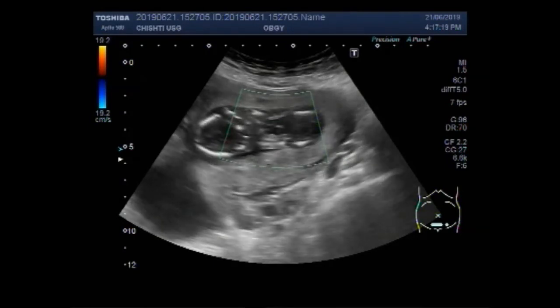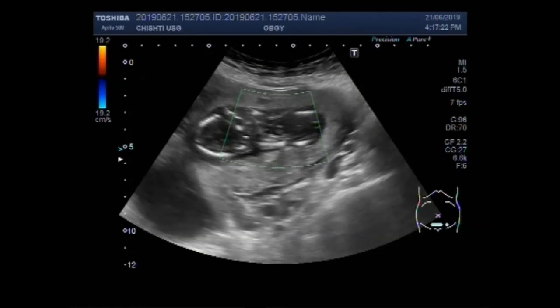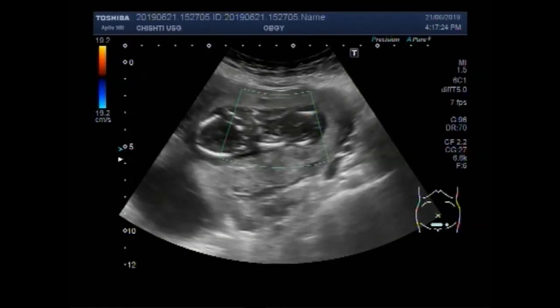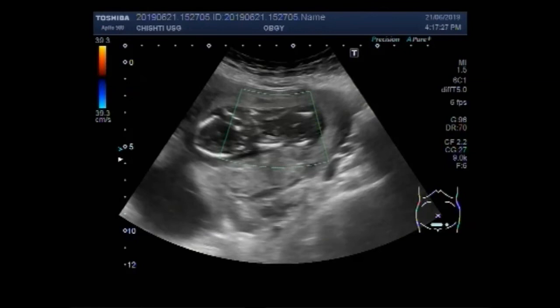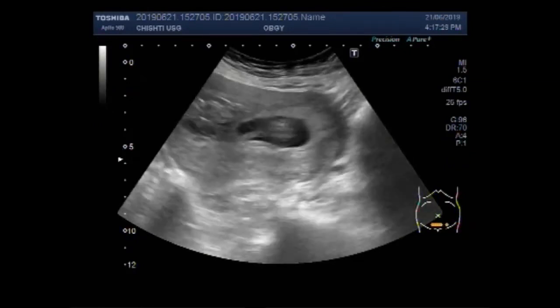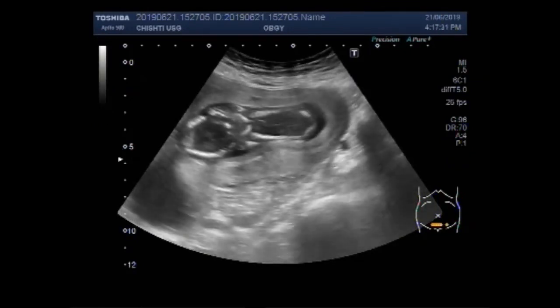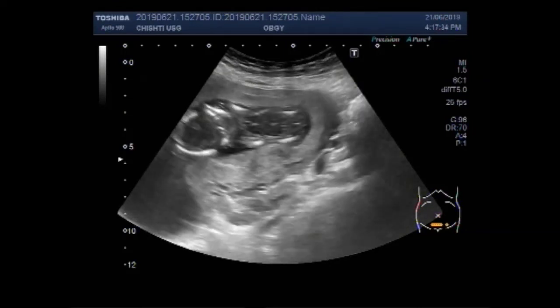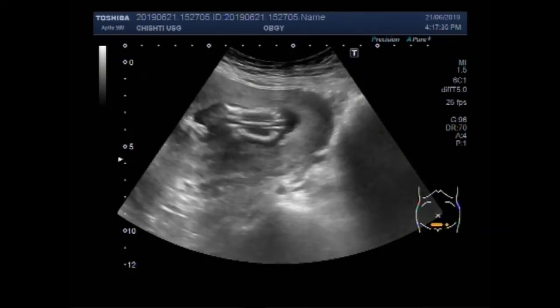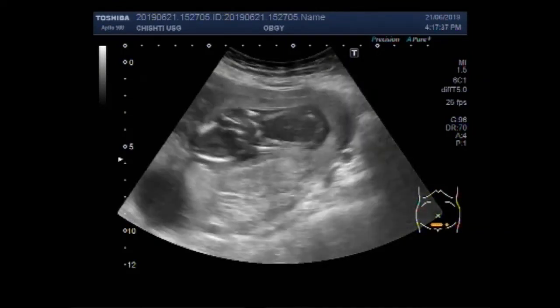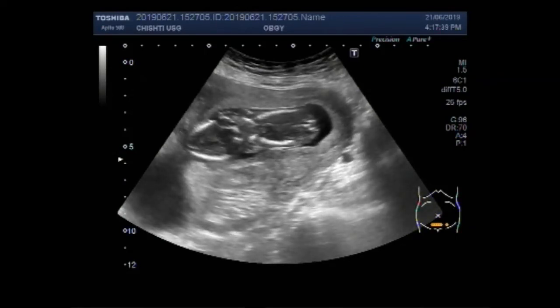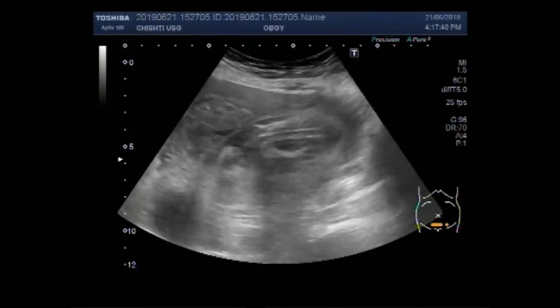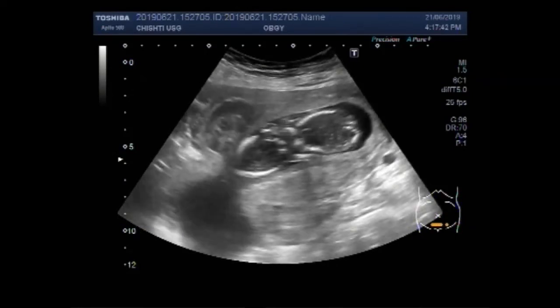So it is a fetus with fetal demise. You can see the fetal skull bones are overlapping each other — that is, the Spalding sign is positive.